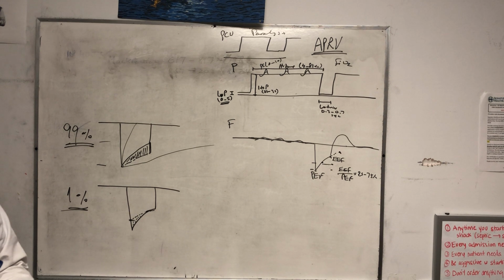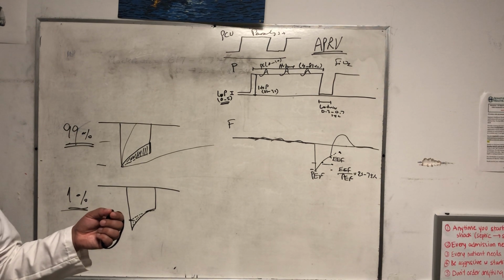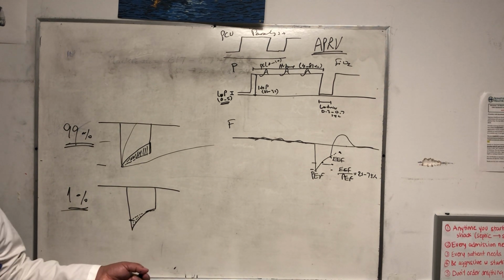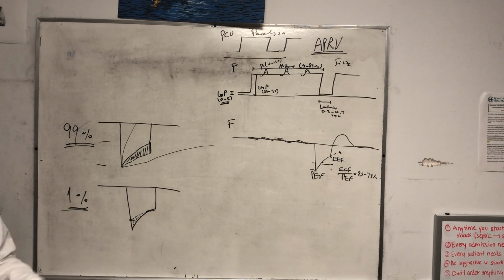So when you reach that level, you increase the time all the way to 0.9, and you still have the ratio in the 70s. That means the COPD is playing the most role, because he's very compliant. I just gave 0.9 and he's still not able to exhale fully.